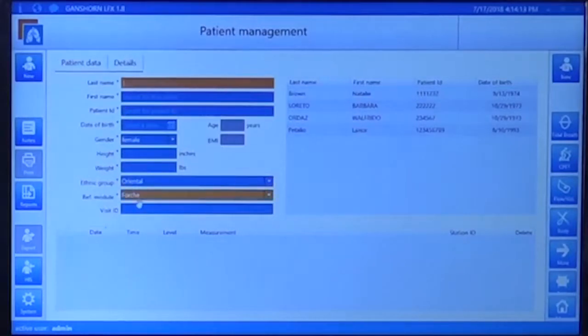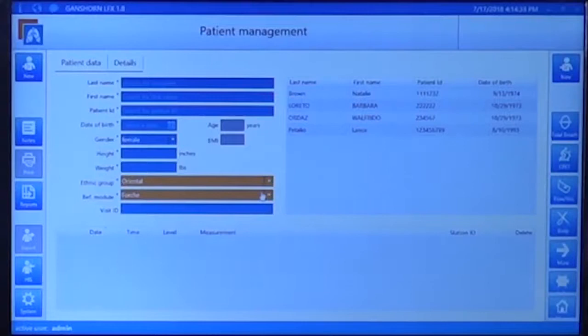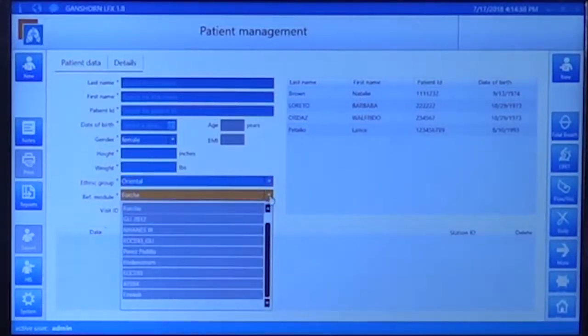All the fields are necessary except for the visit ID. Last name, first name, patient ID, date of birth, gender, either male or female, height and weight, the ethnic group, which can be selected from a drop-down menu, and then the reference module or protocol that you can select also from a drop-down menu. Here you will find the most common protocols for spirometry and pulmonary diagnostics.